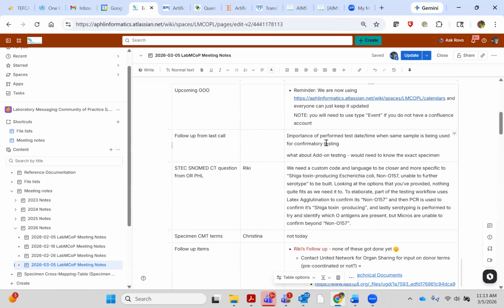Yeah, and I didn't hear her mention that type of example, because that's another use case we've talked about on this call. But I think it was just more the screening and confirmatory. Yes, we were talking screening and confirmatory, so two different test methods, toxicology, used on the same sample.